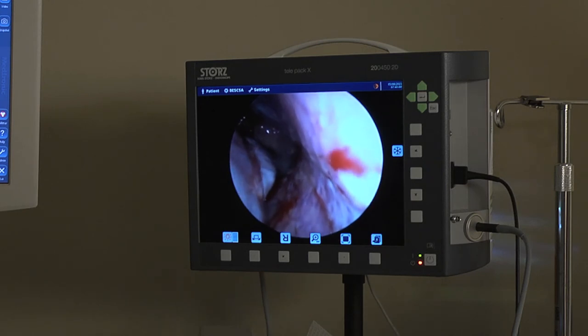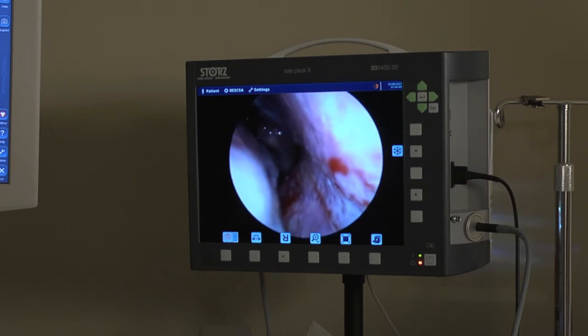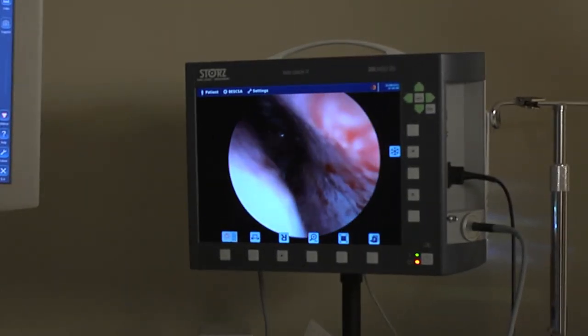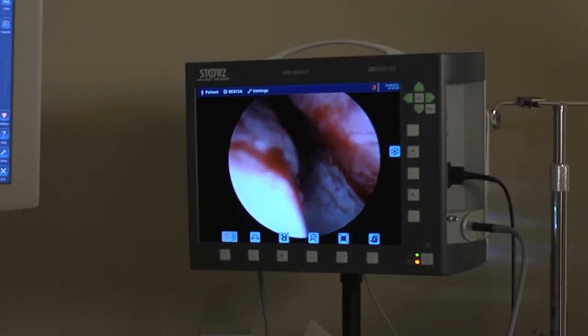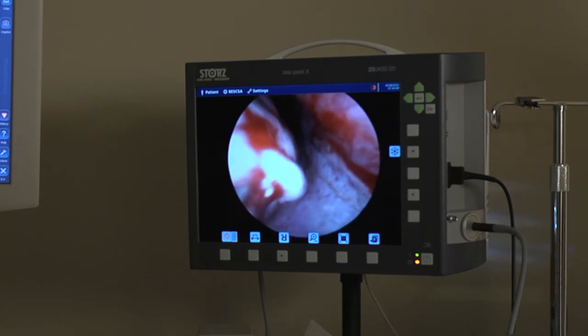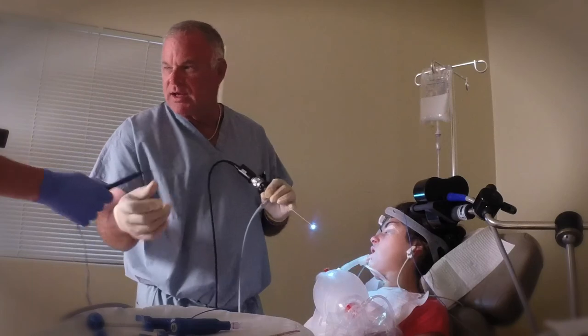Turbinates get larger over time because of chronic allergy and chronic sinusitis. And this little ablation right here will take care of it. This girl, when she wakes up, she should be breathing significantly better. And it should stay like that.